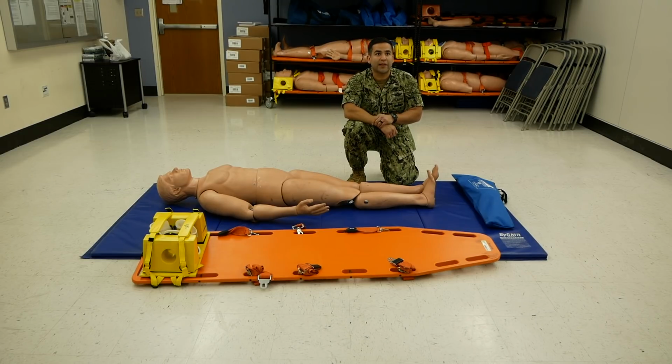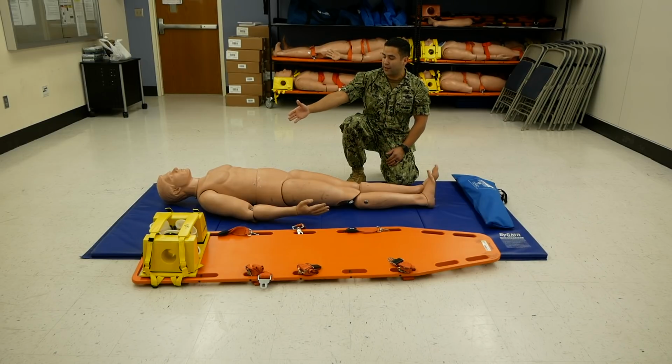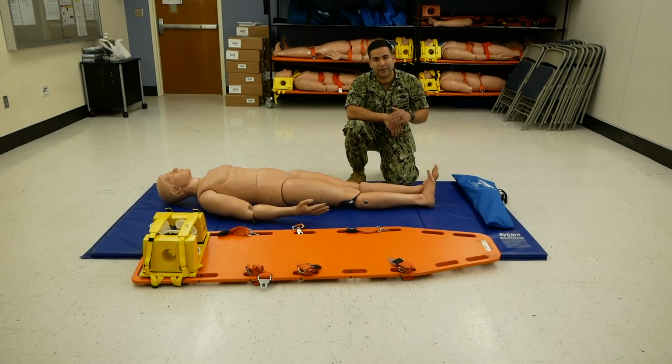Performance Test 20 starts to bring everything you learned from Block Alpha and Block Bravo and compiles it all together, with the addition of the C-collar and traction splint for this one. So we're going to start off with conducting size up. You're going to start with donning your BSI, determine if the scene is safe.